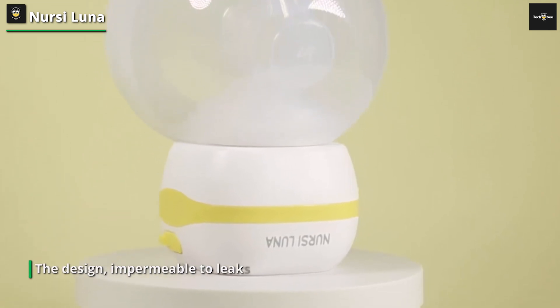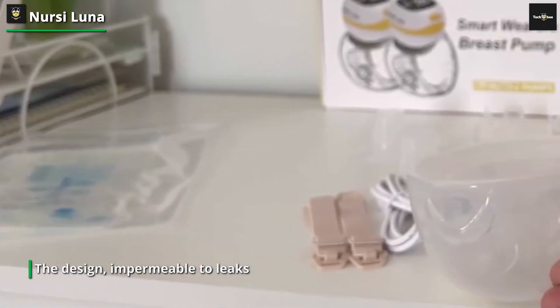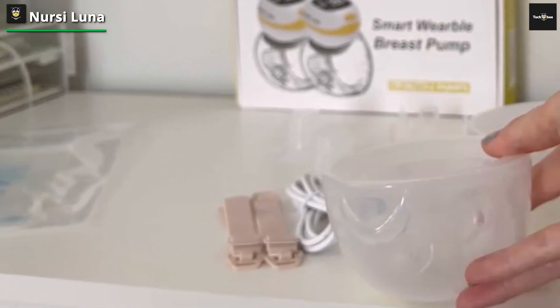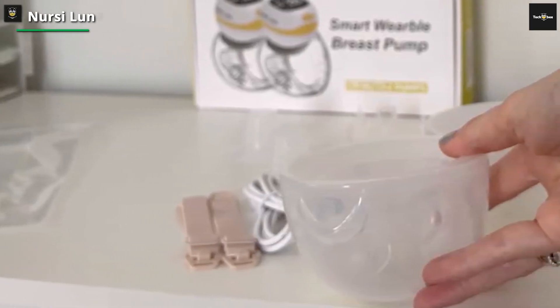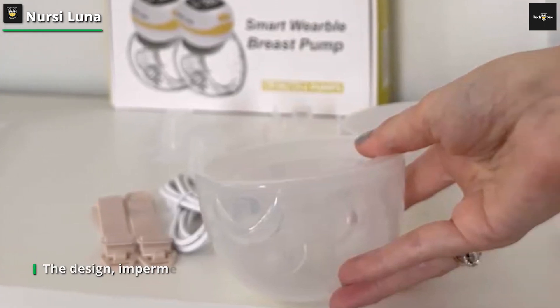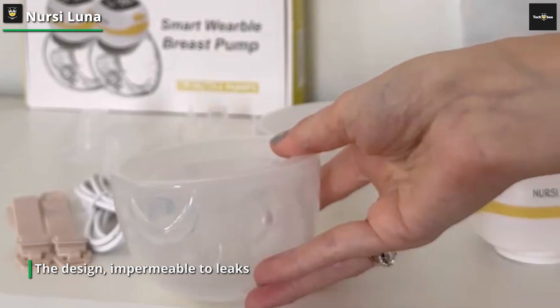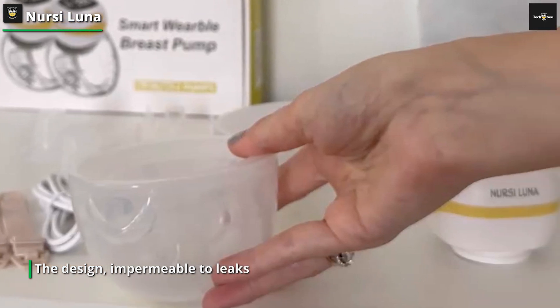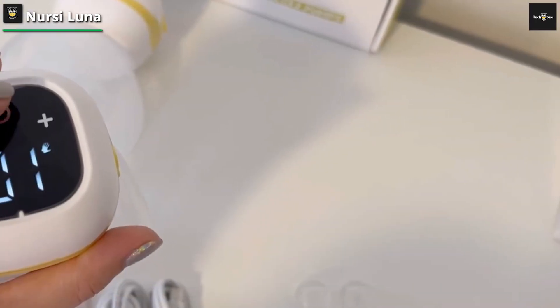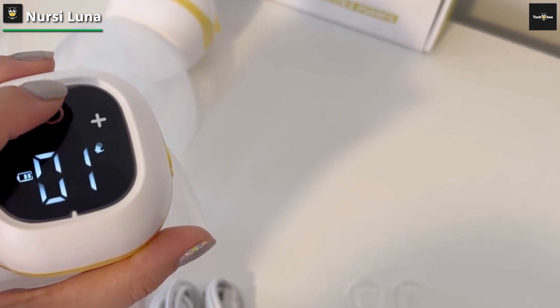The design is impermeable to leaks, precluding any inadvertent backflow. Should any leakage occur, please ensure the meticulous installation of the breast pump. This ingeniously crafted breast pump emulates the rhythmic cadence of a baby's suckling for both comfort and efficacy. It boasts three distinctive modes and a dozen adjustable levels of intensity, encompassing a massage mode dedicated to easing discomfort and augmenting lactation.